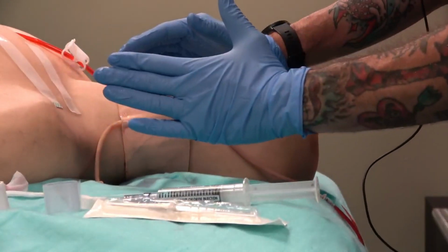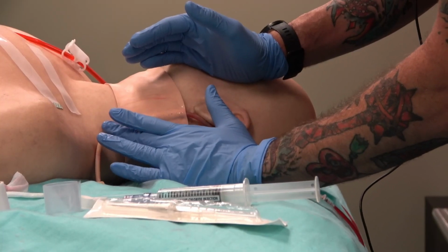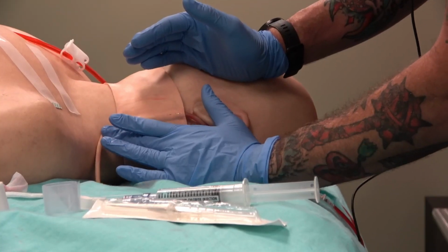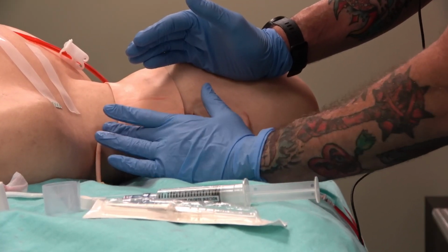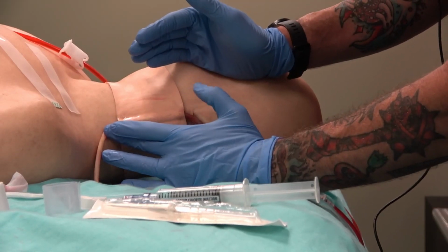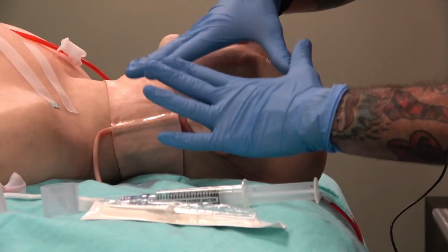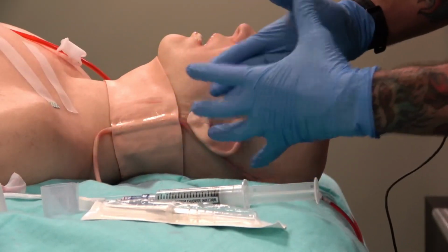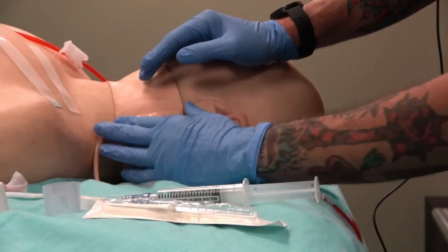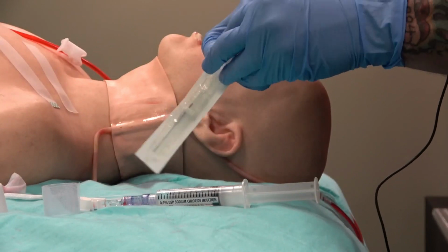And like we talked about before, I'm going to apply some traction above and below. I'm going to occlude at the base of the neck and the nook of that collarbone to make it pop. But I'm also going to take my thumb and apply some upwards traction just to keep that skin nice and taut so that I don't lose my site as skin or adipose tissue rolls over it. Okay. From here, I need to make sure I have my needle.